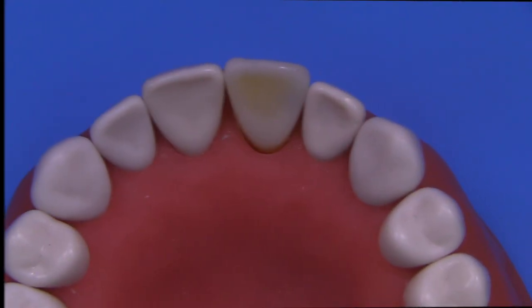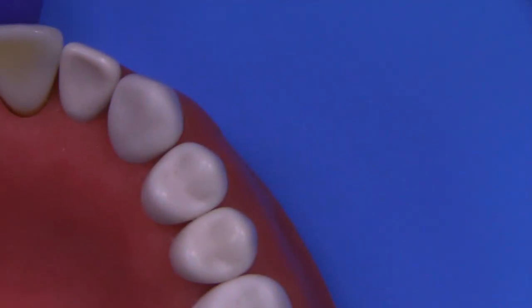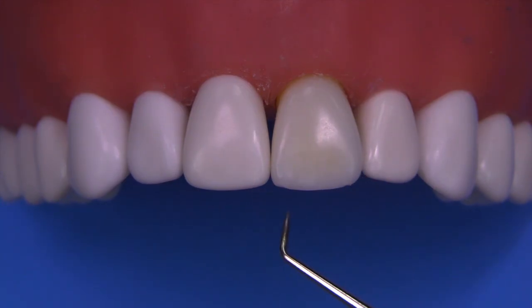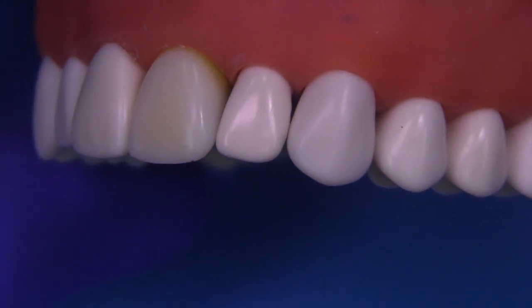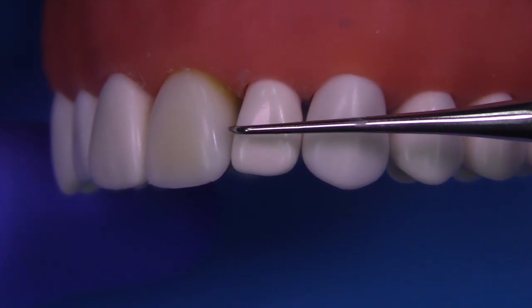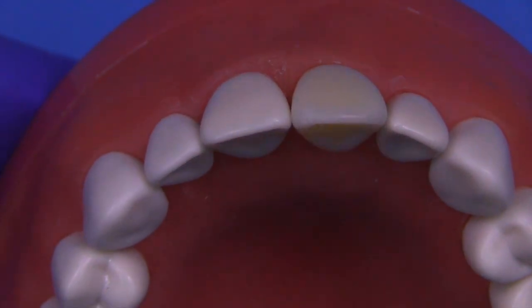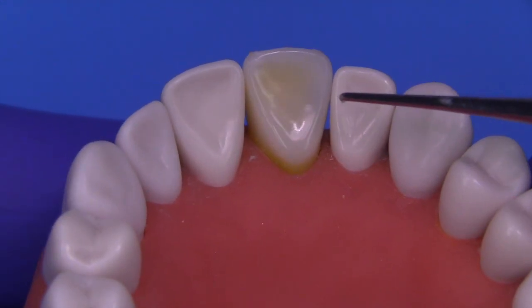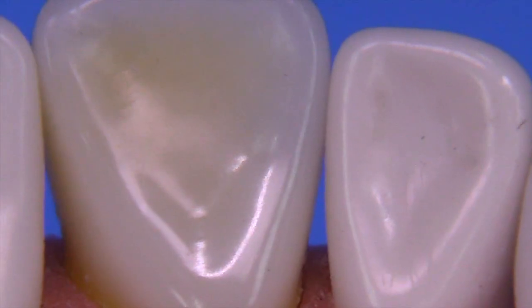The Accidental Module Pro 1 arch is going to be utilized for the examinations — you'll just screw the tooth in there. Here it is from the facial, and I'm going to be working on the distal lingual. That is the surface where the caries has been placed by the company, and we're going to make an access from the lingual because most of the caries is located there. I think a facial approach would not be wise.